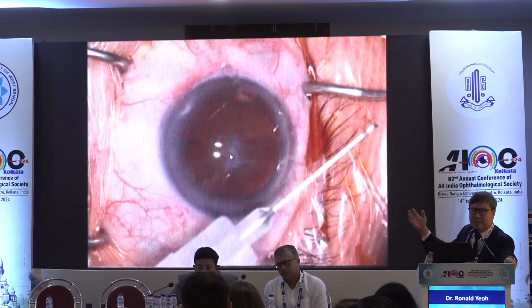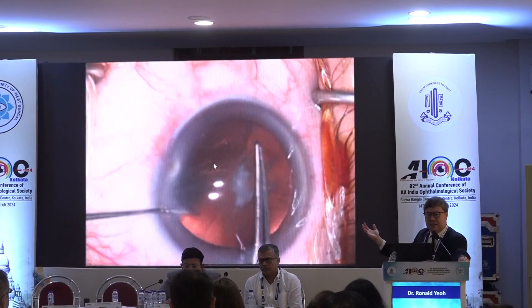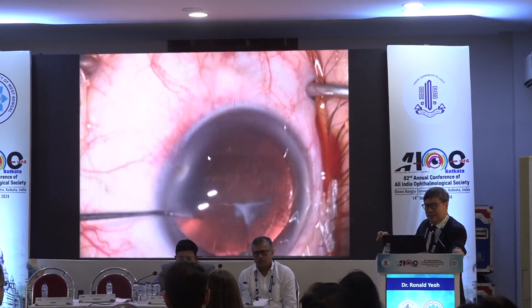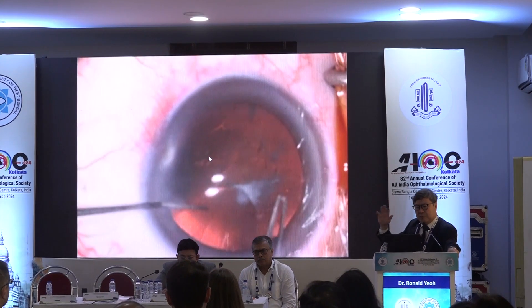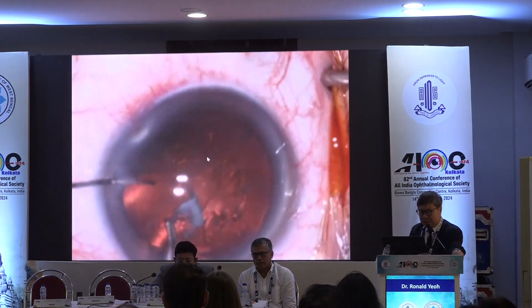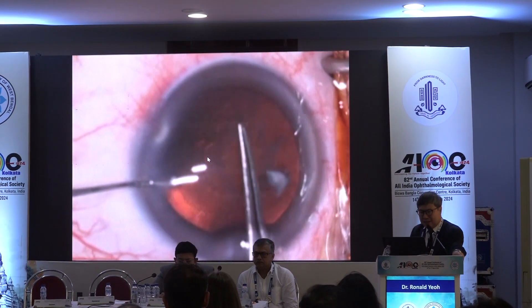Here you can see this fibrous plaque is fairly central. This is easy — you start your rexis somewhere else and just tear around it, and the operation's over because the capsular plaque doesn't really come into play. It's not in the line of your capsular rexis. So that's no problem.